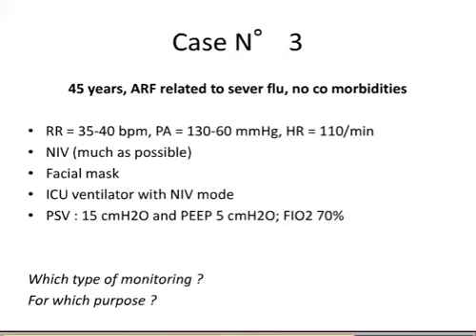Just applying positive pressure will improve a cardiogenic edema, and maybe not an acute respiratory failure. Okay, so the change in central venous... just to see what the SVO2 is right now, to see if it is below 70 or below 60 maybe. So if it's due to cardiogenic edema, the patient is going to improve in just half an hour. Yeah, so maybe we also perform an echography to check... Correct. Okay. Echography may be very useful.